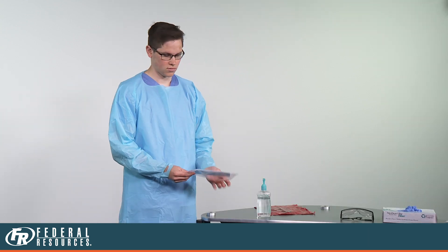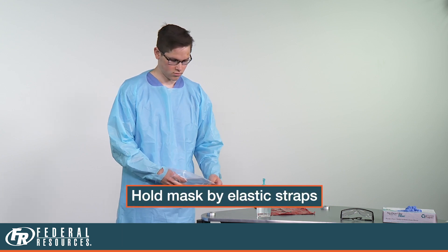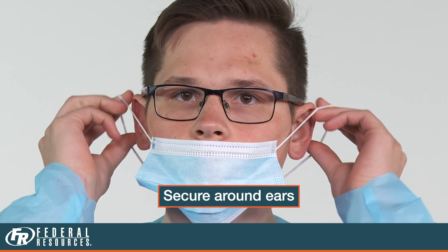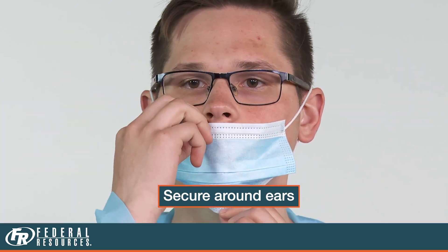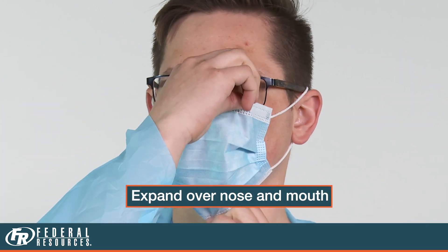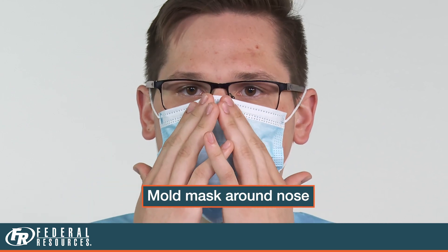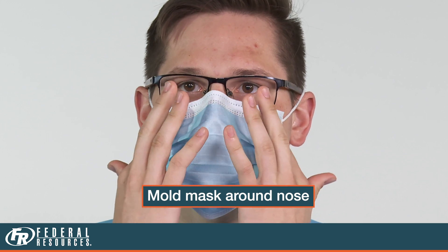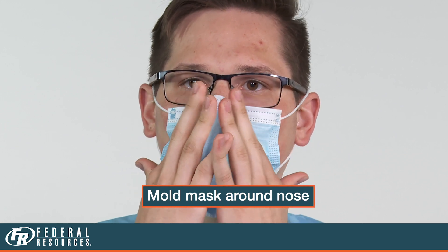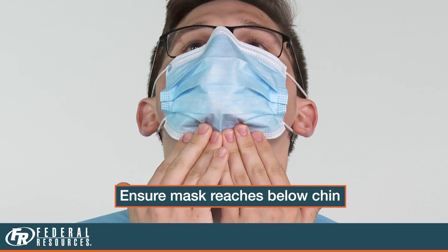The next step is to don your non-medical mask. Hold your non-medical mask by the elastic ear straps. Loop both ear straps around your ears. Once looped and secured around your ears, expand the non-medical mask to ensure both your nose and mouth are protected. Using your fingers, mold the non-medical mask around the bridge of your nose, down the side of your face. Ensure your non-medical mask reaches down to below your chin.